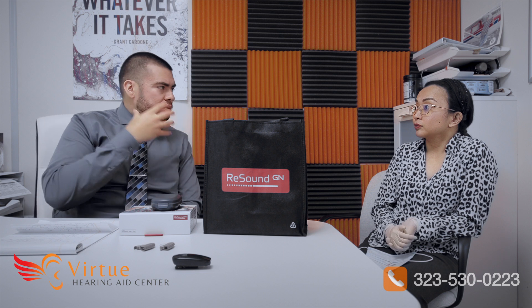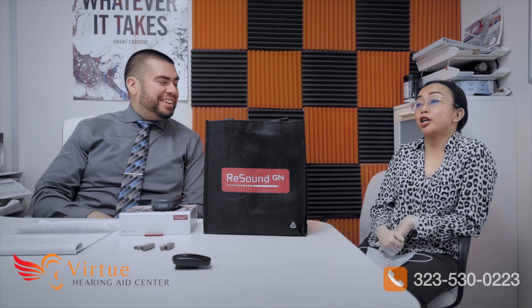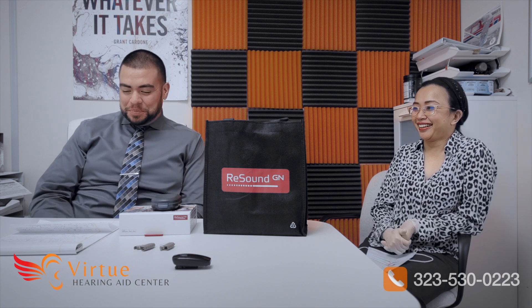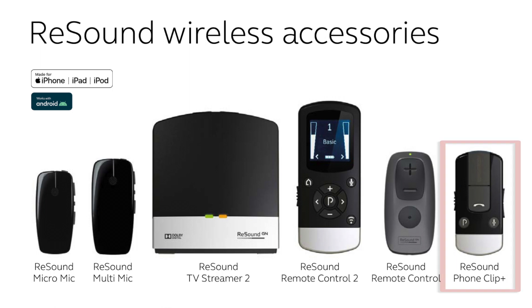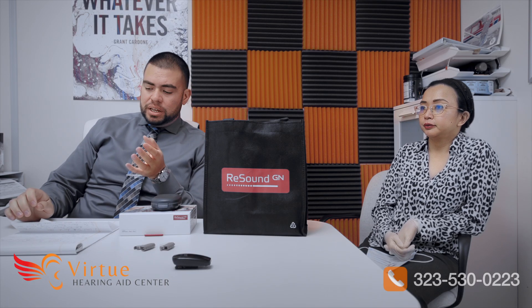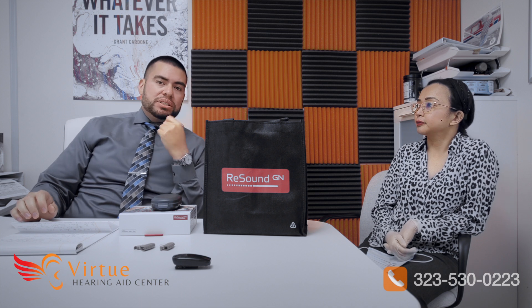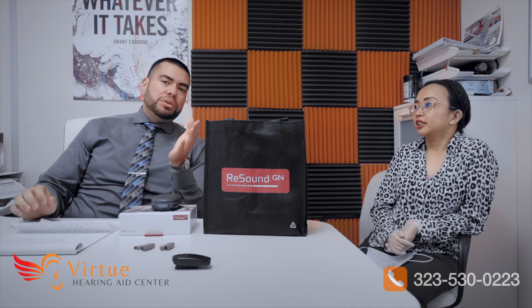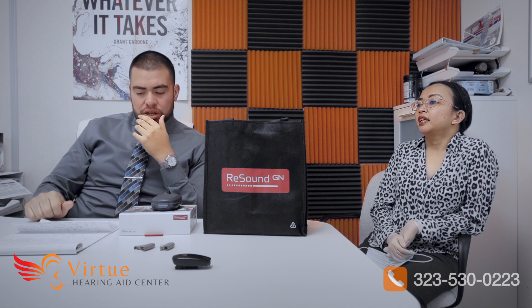So the hearing aids would deliver a surround sound type experience. Then there's the phone clip — if you have an older phone like an iPhone 4 or Android 8 and still want Bluetooth connectivity, you use the phone clip accessory to stream from your older phone. It can actually connect to two devices, so if you have two phones or want to connect to your car that works too.